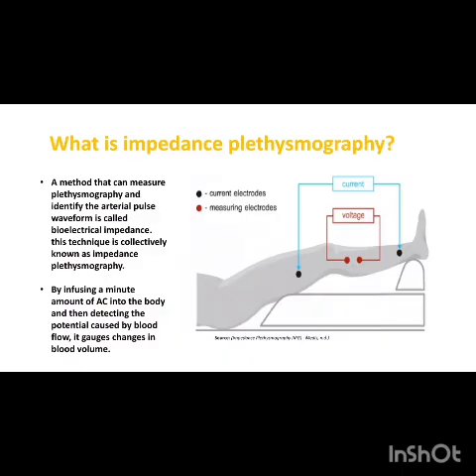Another practical device is the mercury-filled strain gauge, which continuously measures the circumference of the mid-calf. Plethysmography is a non-invasive method used to detect vein thrombosis in areas of the body.